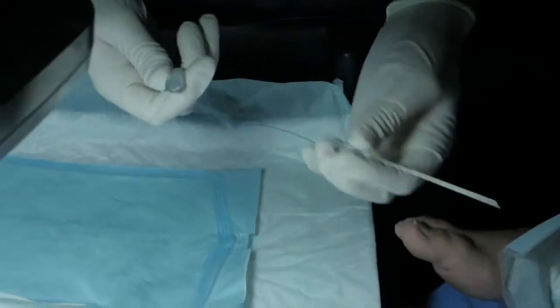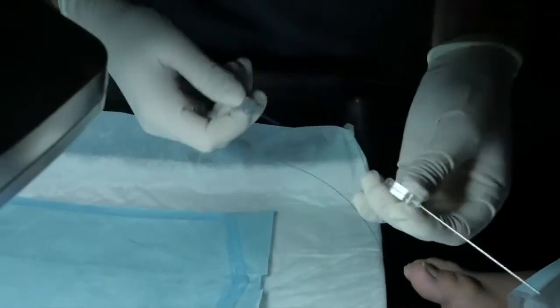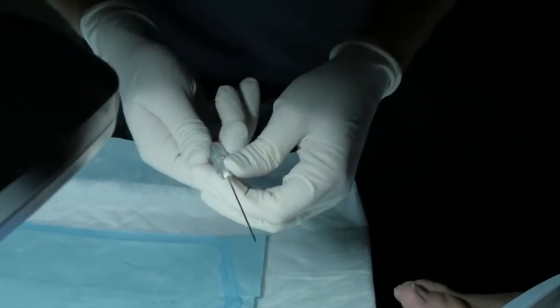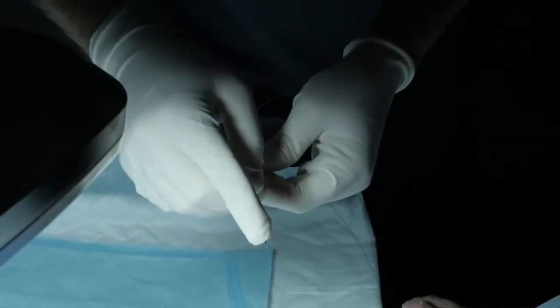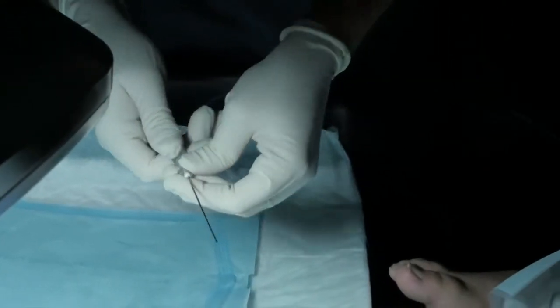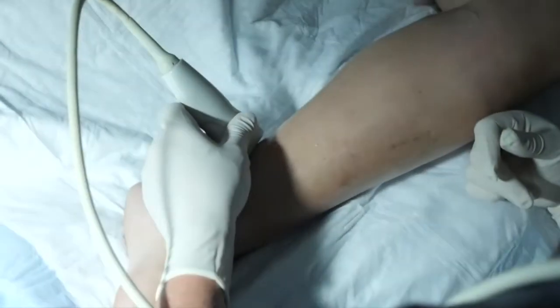So here we have a spinal needle with the perforator fiber. You want the fiber to be extending beyond the tip of the needle by 2 to 3 millimeters. So here we're measuring the fiber and we're going to position that so that it's 2 to 3 millimeters beyond the end of the needle.